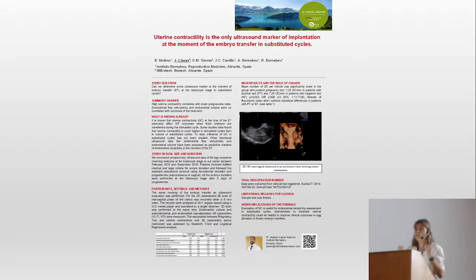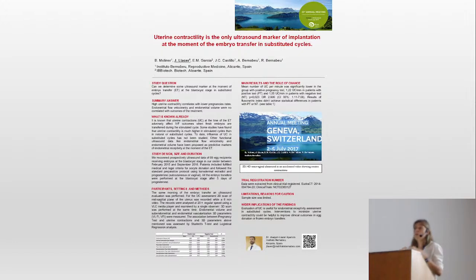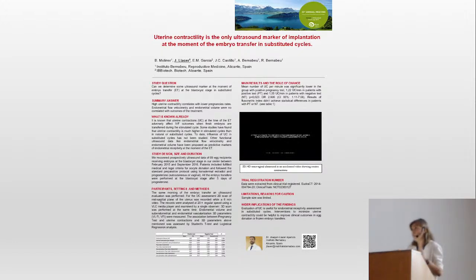The only ultrasound marker that we really saw associated with pregnancy was the contractions. And we saw that the patients without pregnancy had contractions more than 1.5.